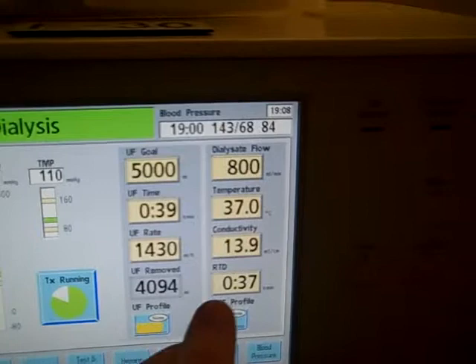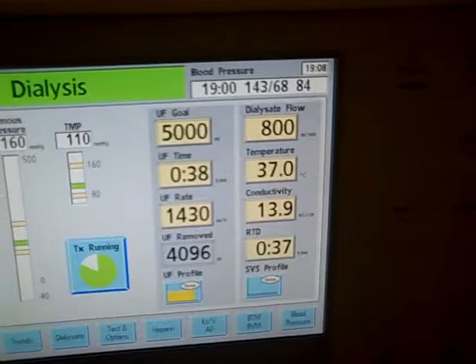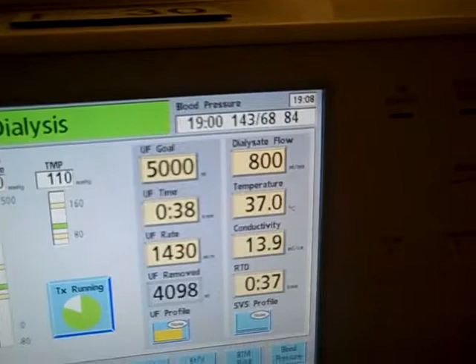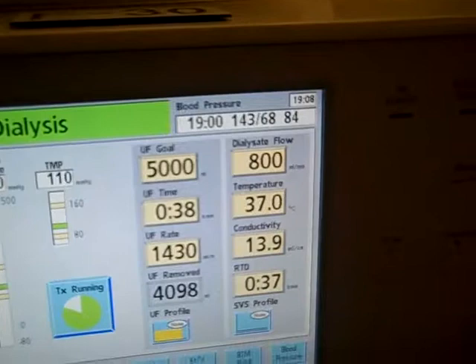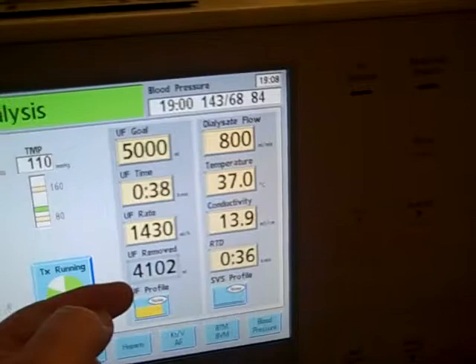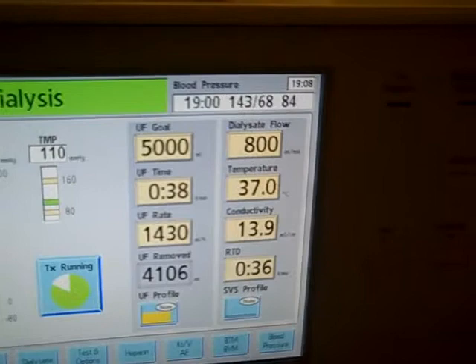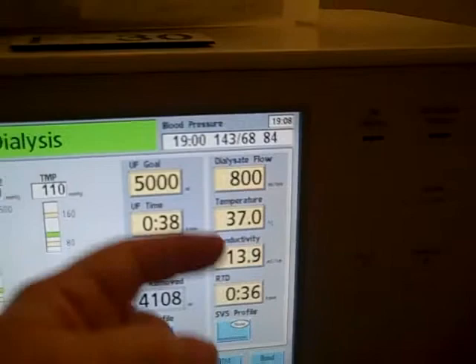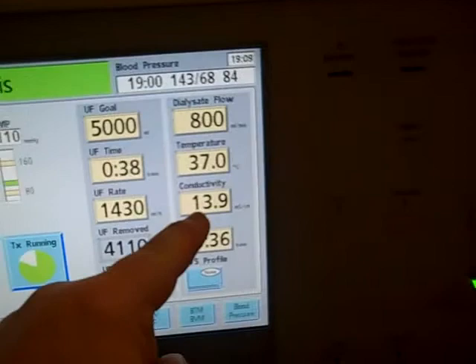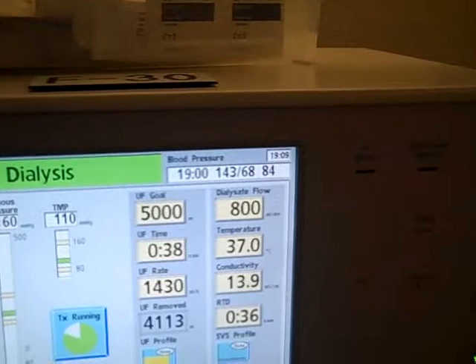Ultrafiltration profiles and sodium variance profiles are settings we can use to help the patient from experiencing side effects like cramping. His goal was 5,000 milliliters today; so far he has 38 minutes left. This shows how much we're taking off per hour and how much we've taken off so far. This is the flow rate — a general flow for the dialyzer running in and out of the machine. There's also a temperature setting, because when blood comes out of the body and runs through a machine like this, it needs to be heated back up. The machine has heaters inside for keeping the blood at a warm temperature. Conductivity relates to some of the various chemicals used in dialysis, like bicarb.